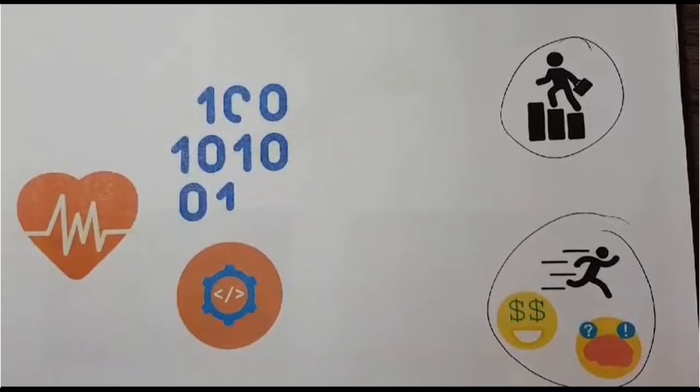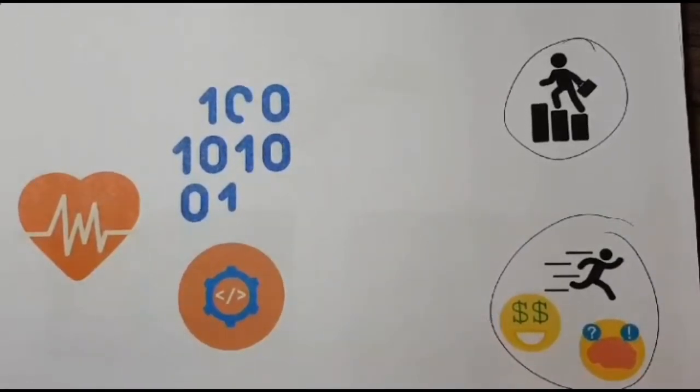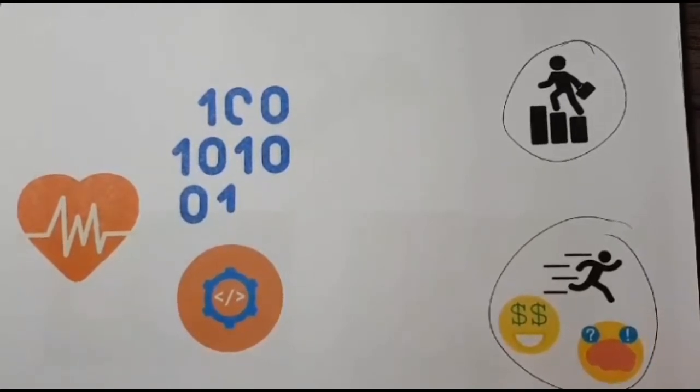Rate-responsive pacing increases the patient's heart rate according to metabolic needs during physical, mental, or emotional activity. This pacemaker sends varied levels of electrical impulses to adjust the patient's heart rate, depending on signals from the sinoatrial node of the heart and physiological signals such as breathing rate and blood temperature.